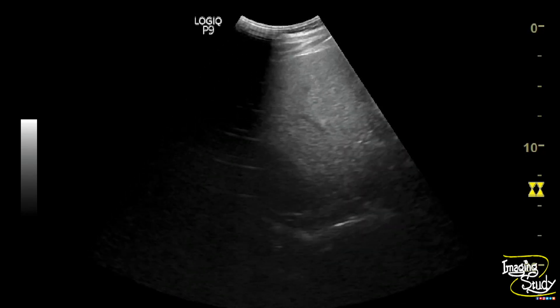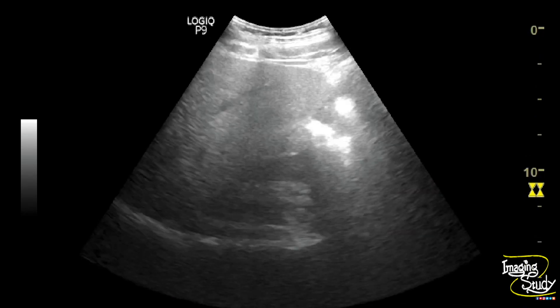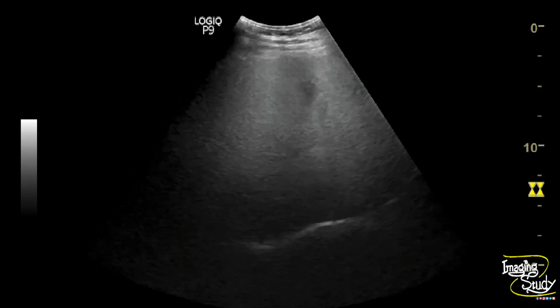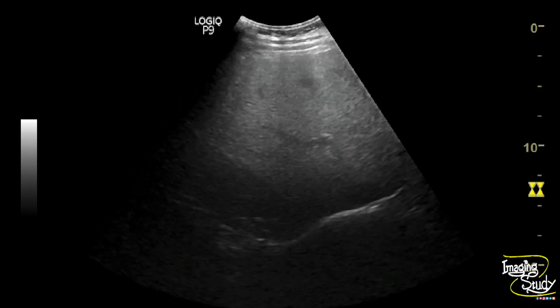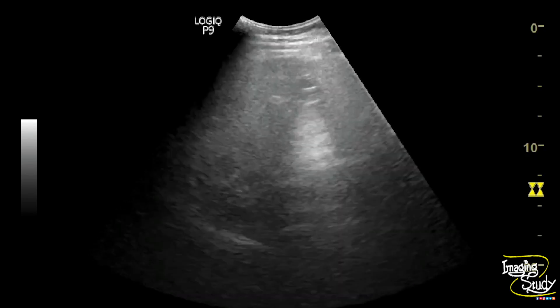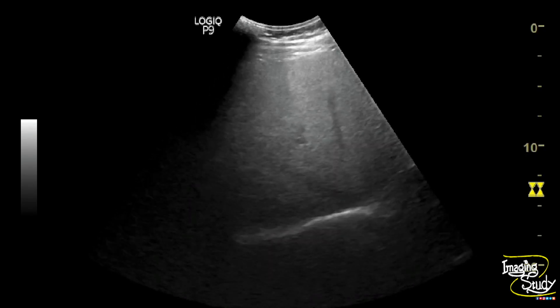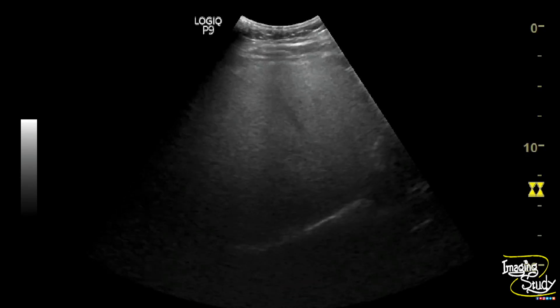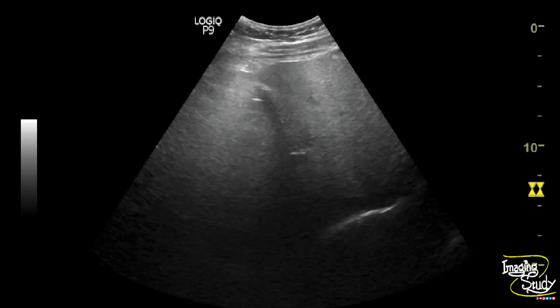Moreover, you can see the intrahepatic vessels and diaphragm here, but these are not too bright, so impaired visualization of intrahepatic vessels and diaphragm is a feature of moderate hepatic steatosis.